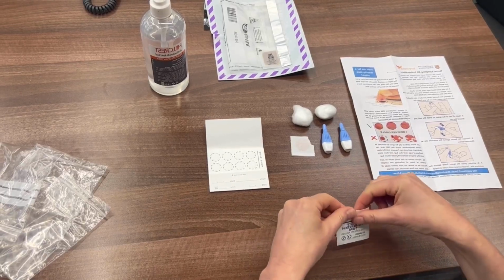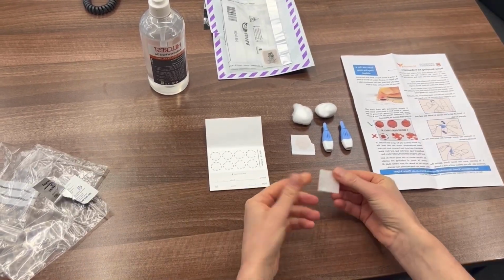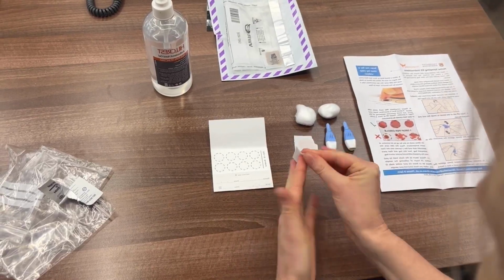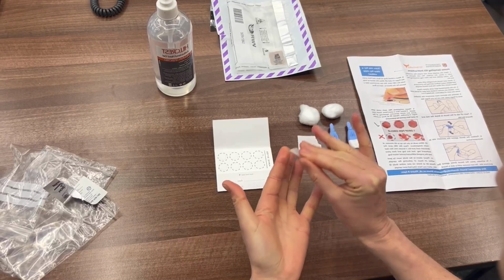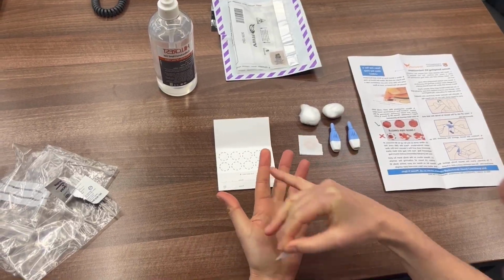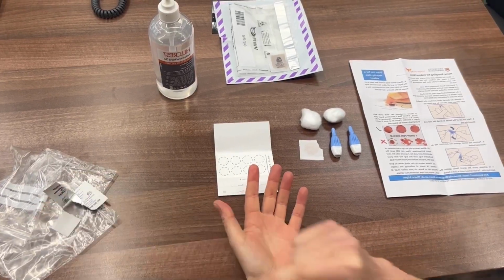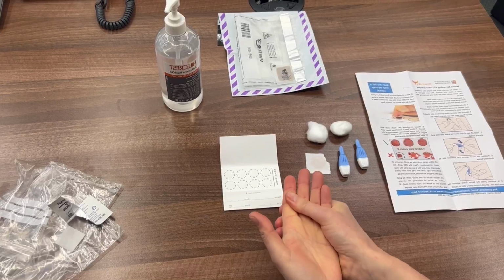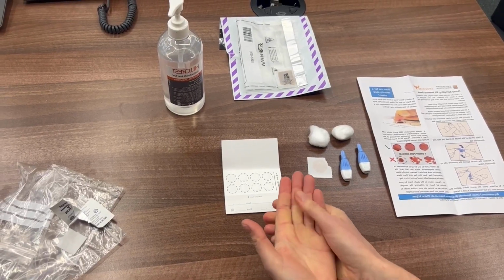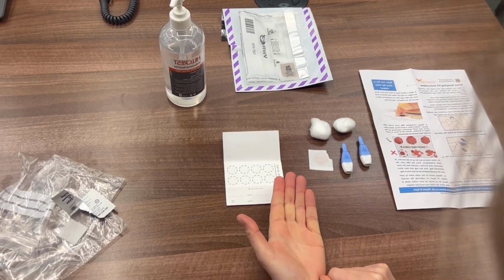So the first thing that we do is clean the tip of the finger that we're going to use. And I'm choosing to use my first finger there. What I also make sure is that my finger is nice and warm. If you've got very cold hands, sometimes you don't bleed so well.